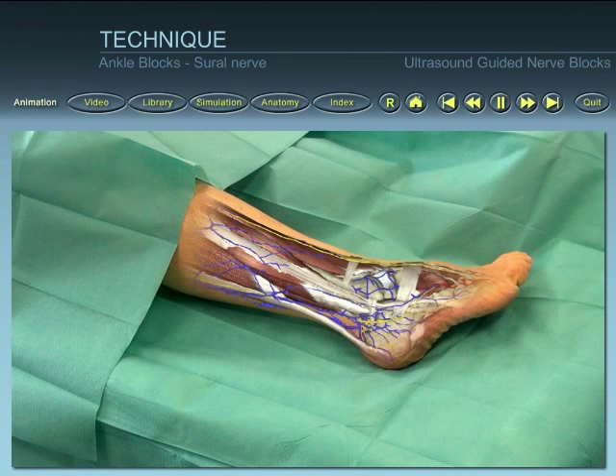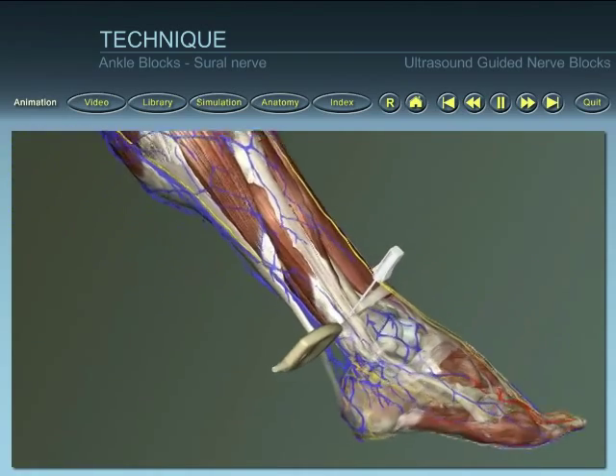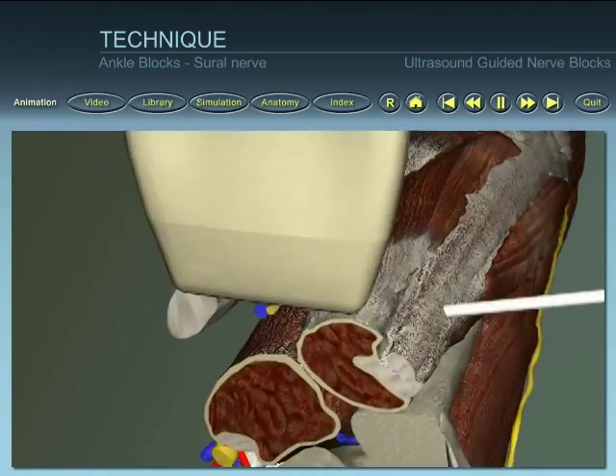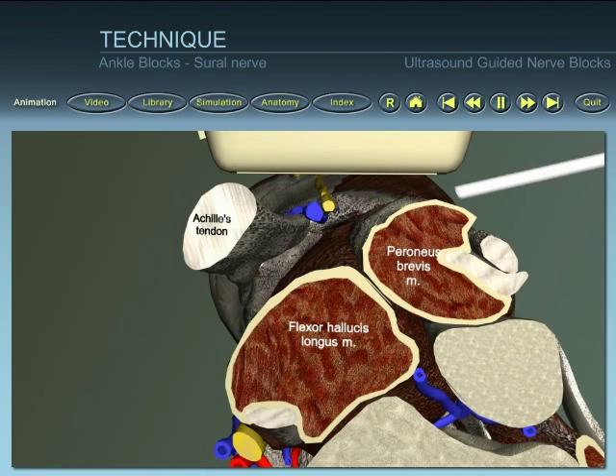Position the patient and identify superficial landmarks. Place the ultrasound probe on the skin. Insert the needle at the outer anterior end of the probe. Identify the needle within the ultrasound beam and direct the needle towards the sural nerve.